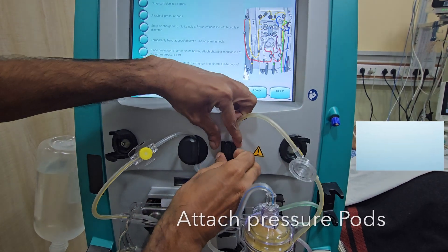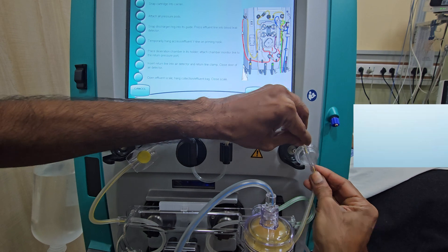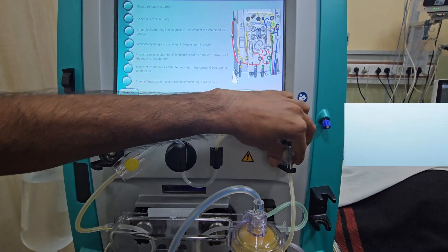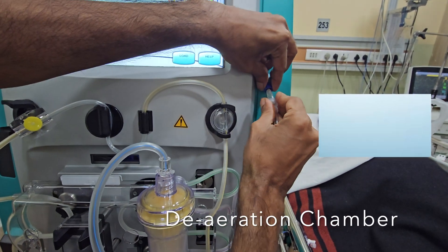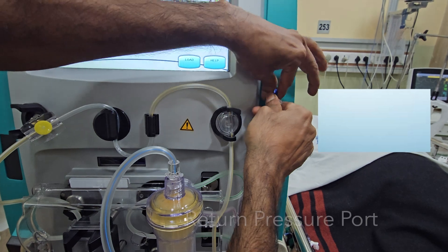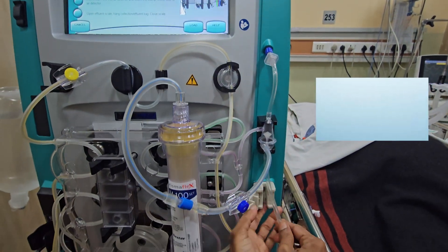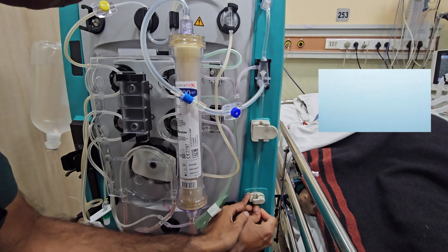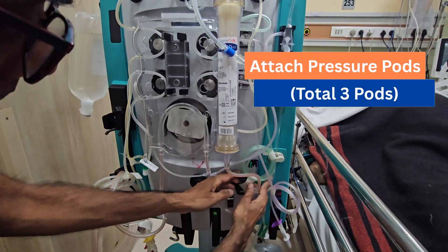Attach pressure pods. Deaeration chamber connected. Return pressure port connected. Air bubble detector attached. Return clamp set. Two more pressure ports attached.